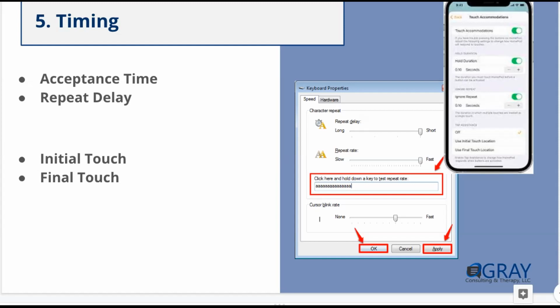So I work low, like 80%, 90%, whatever the user is comfortable with, and if they're able to give feedback, provide feedback about their level of accuracy, because you're going to make mistakes and it's okay. Everybody does it. And so the other features that you might have within this timing setting is that the activation occurs when you very first touch the screen, or the activation occurs when you've let go of the screen.